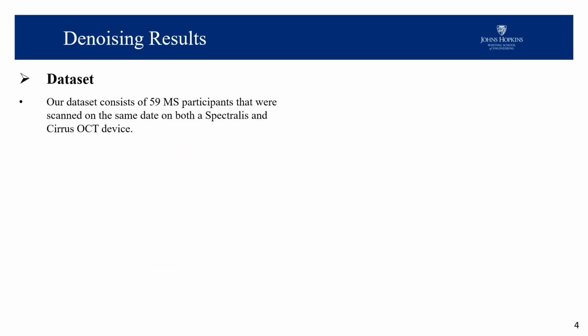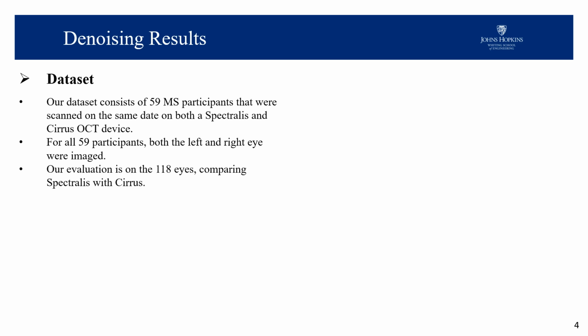Our dataset consists of 59 MS participants that were scanned on the same date on both Spectralis and Cirrus OCT devices. For all 59 participants, both left and right eyes were imaged. So our evaluation is on the 118 eyes, comparing Spectralis with Cirrus.